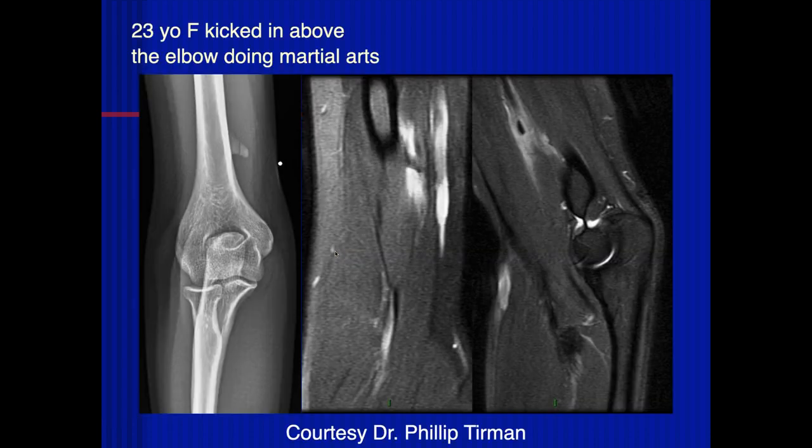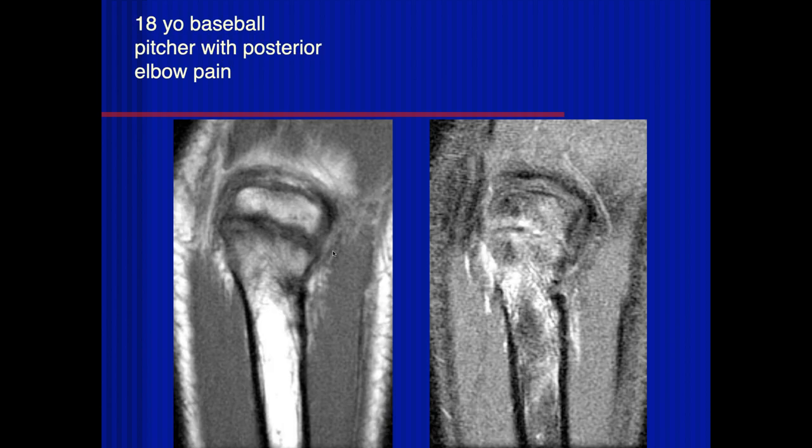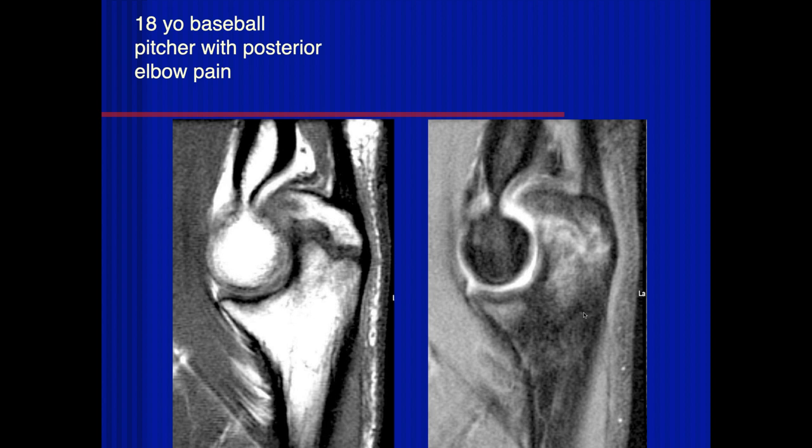Right here. That looks to me like a fracture of the neck. This is the olecranon here. This is a coronal posterior view. Oh, I see. Right, coronal view. You got me all confused. Yeah, it's easy, right? I know, when we just show individual images like this, it's easy. Sorry. No, it's perfectly understandable.